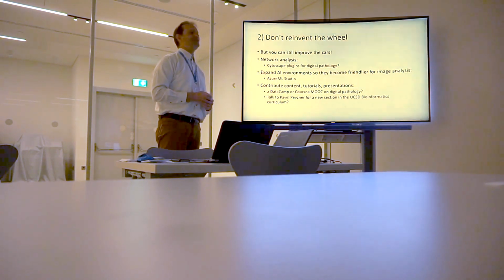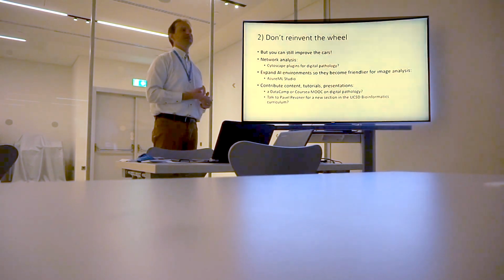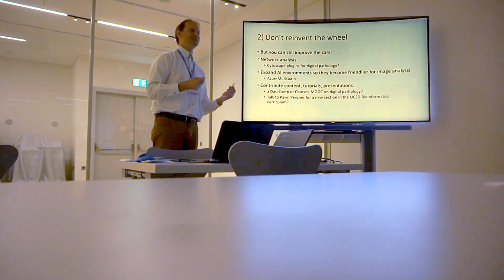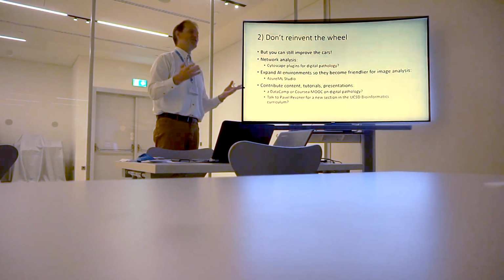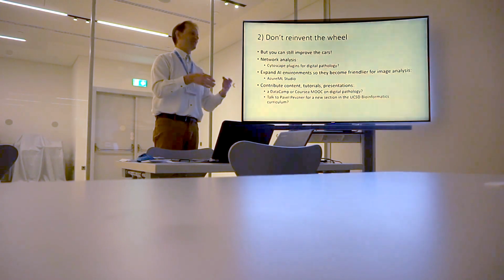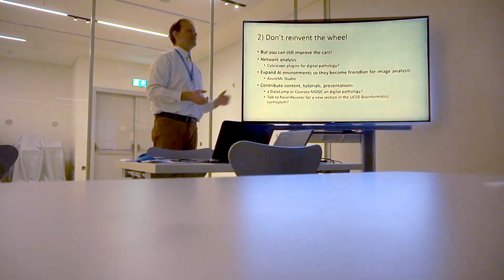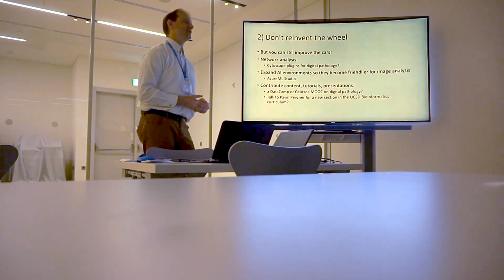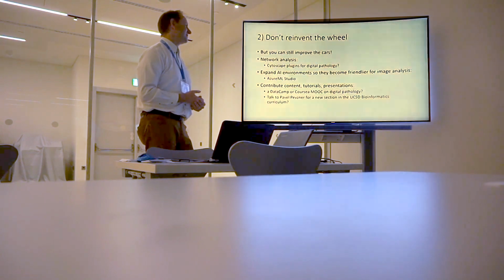But Azure ML Studio completely goes haywire. It's completely not useful once you get to imaging data. The imaging data is converted into a 2D array, of course, which is then flattened to a 1D array, and then those arrays are fed in. So you kind of end up with a digital version of the smoothie, right? And you lose your features, and so I think there's a lot of stuff to be done in this space because deep learning is hot. It's just that we don't have any good tools to address it.